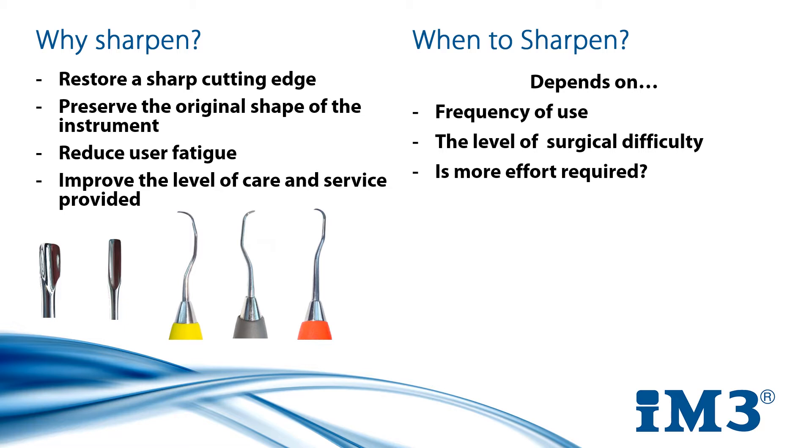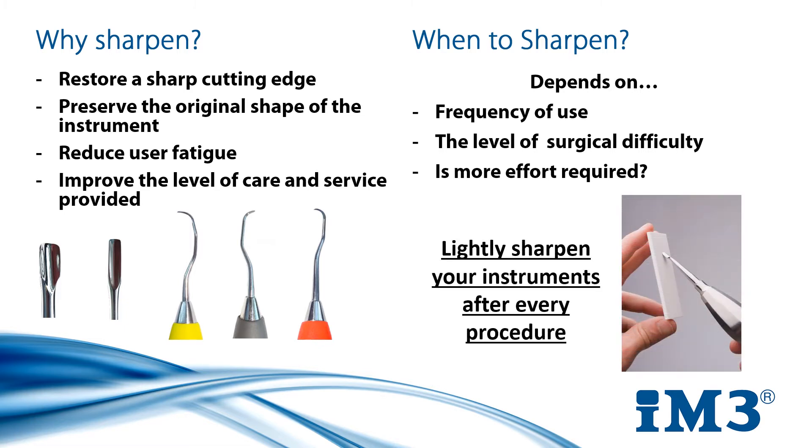All these factors mean there is no set answer on when to sharpen, but a good rule of thumb is to lightly sharpen after every procedure. This is good practice and it means that you will never be in a situation where you have an anaesthetised patient in front of you with an unsharp instrument.